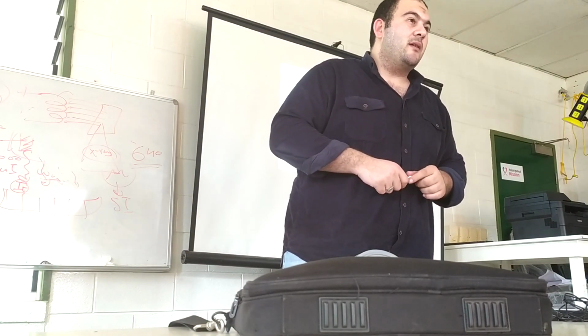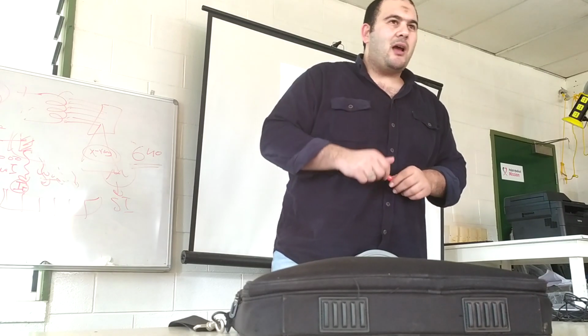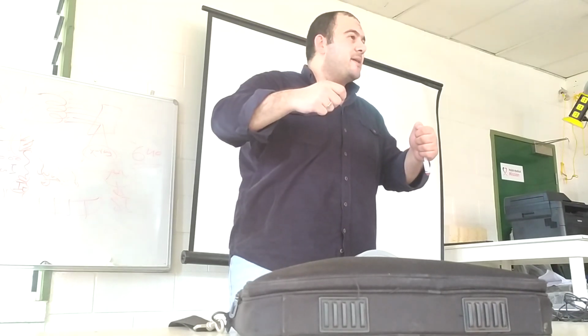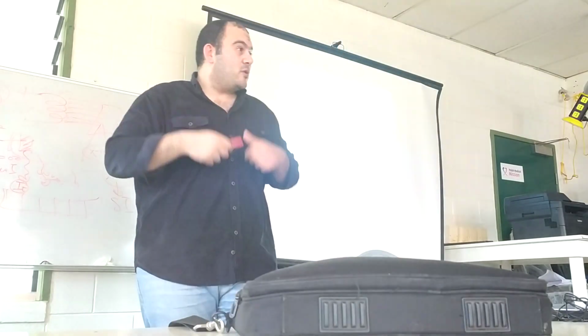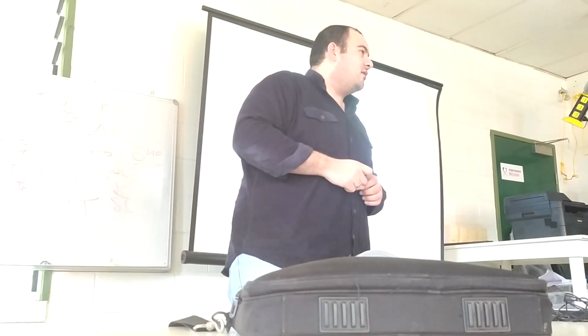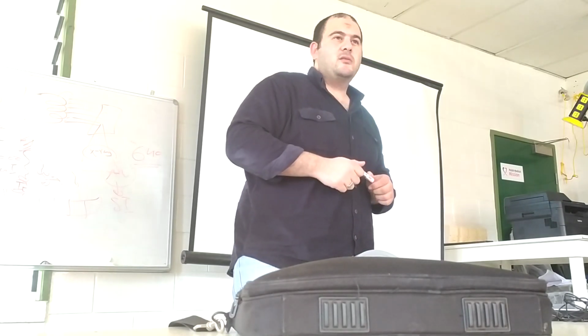That's very important. Why? We are saving the patient, and we are saving money as well, okay? Because the X-ray tube for CT has a lifetime. If we are exposing the patient to higher radiation, the X-ray tube will be damaged in a short time. If you want to replace it, you will pay a lot. So it's very important, okay?